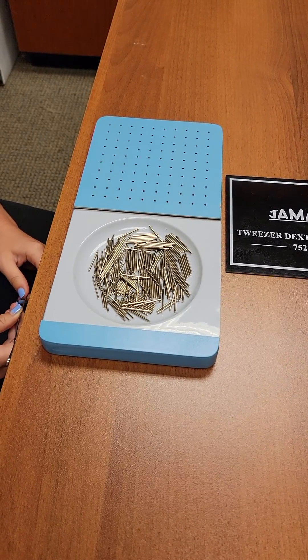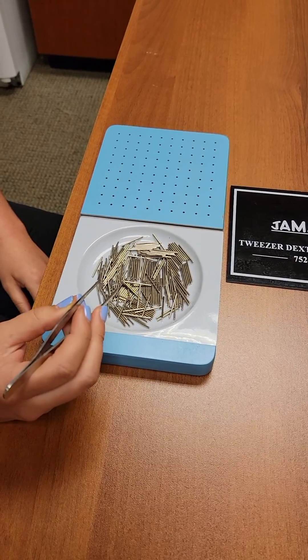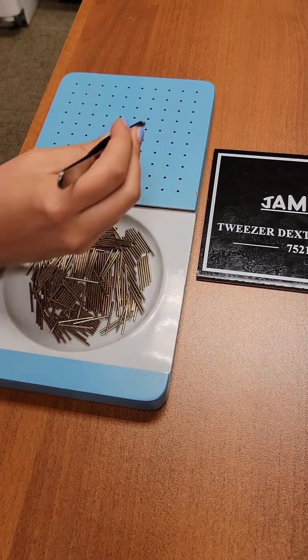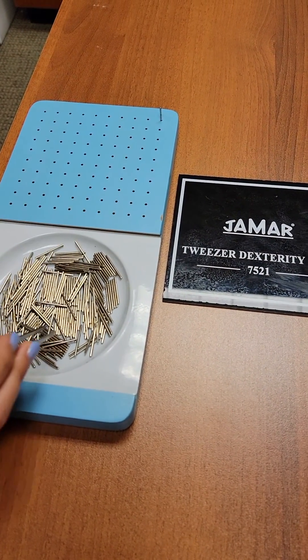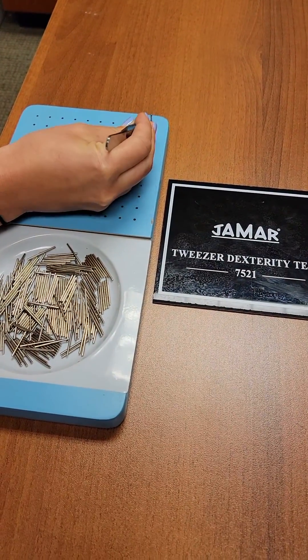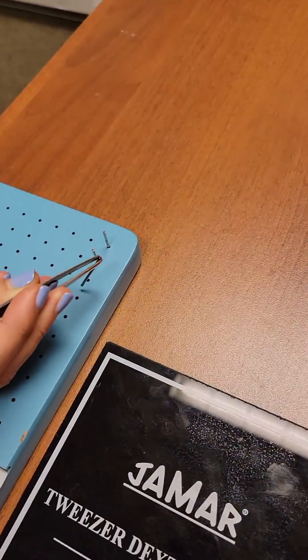Today we're going to just show you a couple of rows. Andrea will start with the pegs and the tweezers. There's a standardized set of directions, but we'll advise the patient to try to take the pin loosely in the tweezer so that it kind of just falls into the hole like that.